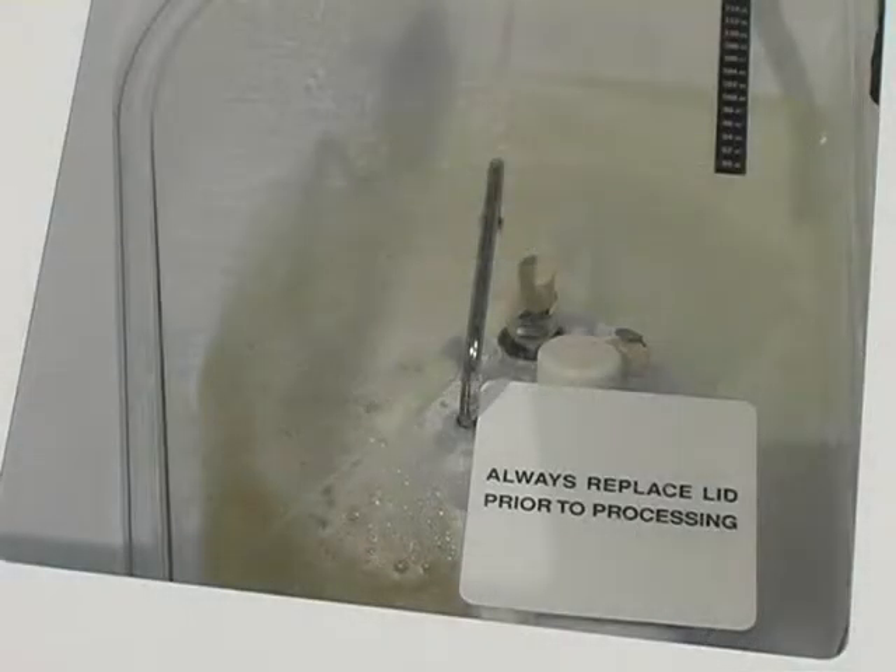An automated alcohol purge facilitates channel drying and prevents bacterial growth. This video program supplements but does not replace the information provided in the DSD-201 user manual, which came with your endoscope reprocessor. The program is divided into ten sections for easy review.